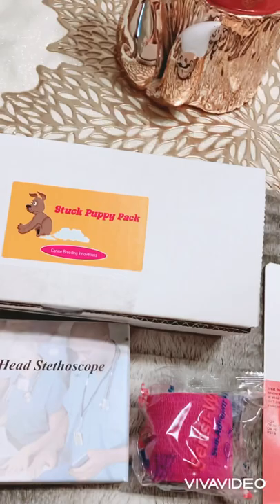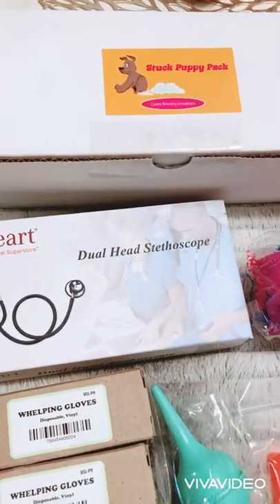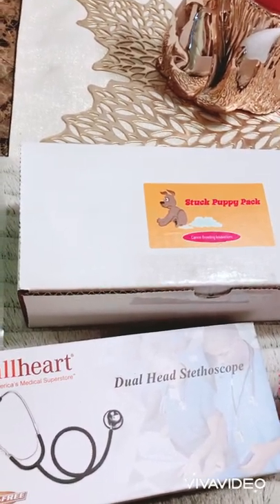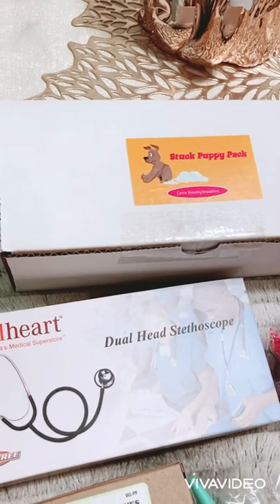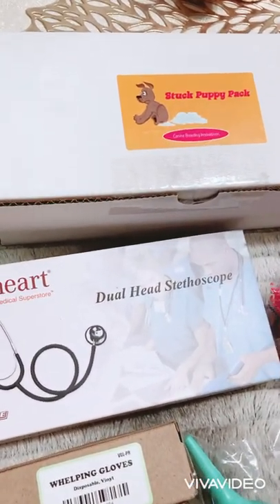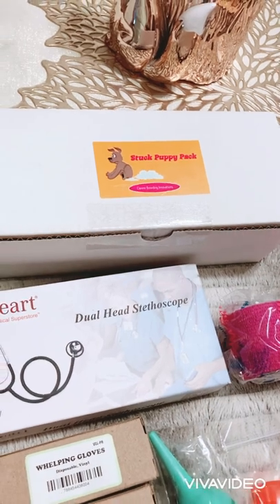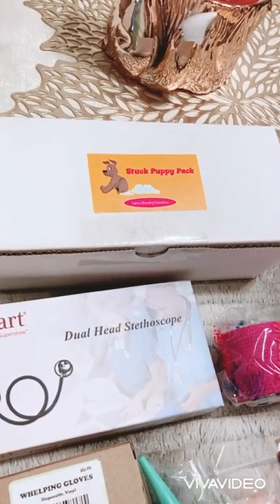They also give you a stuck puppy pack. This is if you're having any issues delivering the pups, or it's been too long since the mom had a pup and she might need some help getting it out — in case they're breech or there are any issues where she can't get it out on her own. In that kit there's some lube, some PVC tubing, some syringes, another suction bulb, more gloves, and whelping pads. Basically it's a mini kit of what we already have. It also includes instructions on what to do if a puppy is breech or stuck, to help you try to do it on your own if you don't have time to reach a vet.